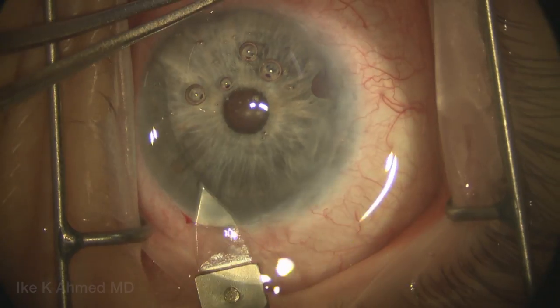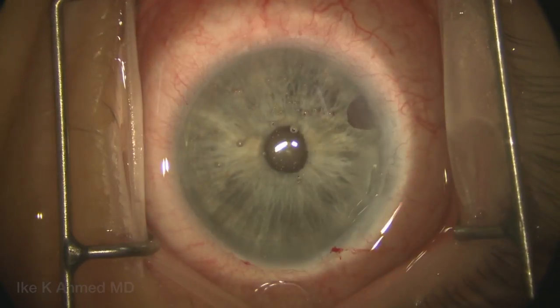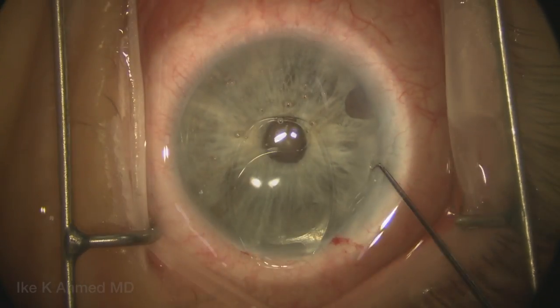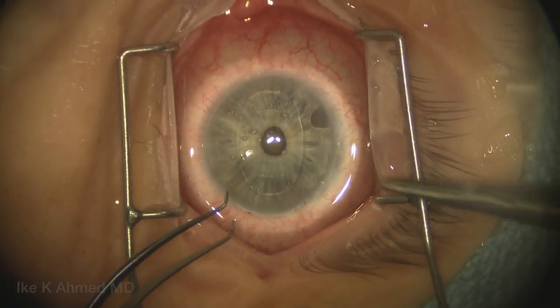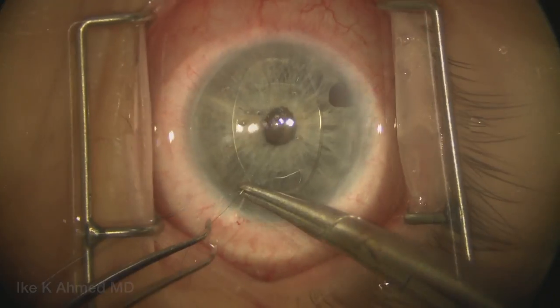At this point, the incision can be further opened up with the diamond keratome. We're going to enlarge this incision — remember, a 300-micron groove — enlarging it to 6mm in length. The Artisan lens has been placed with a curved introducer partially into the incision, and then a Sinski hook is used to place it entirely in the anterior chamber, where it now sits waiting for enclavation.